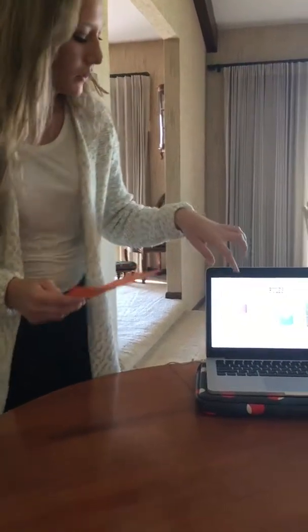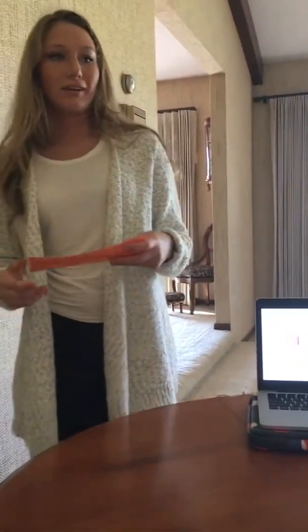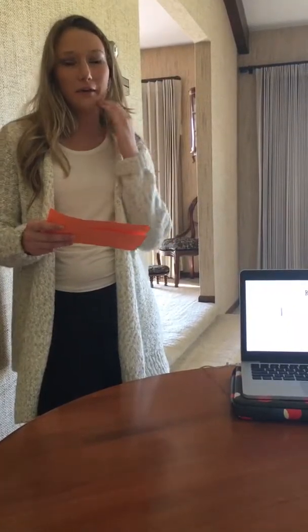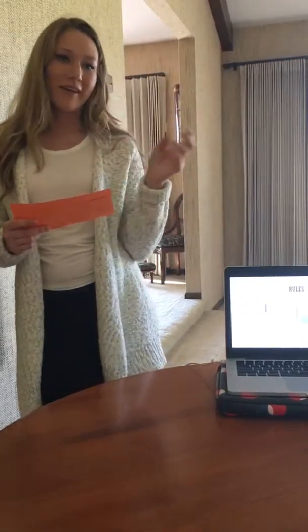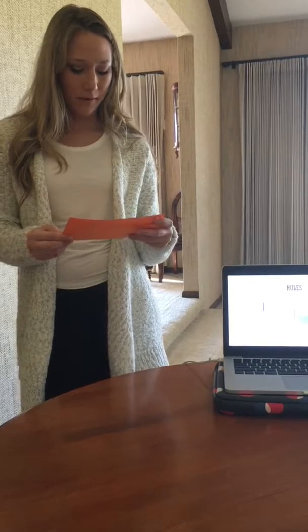There's a small dot when you look closely. There's a small dot shown on it, as you can see in your handout also. This dot will also be facing downwards towards the patient, the bottom of the mouth. When it's in the mouth, the dot will always go down. Then, if you look at the PID, you'll always need to remember to change the angle and the time, depending on where you're taking this x-ray in the mouth.